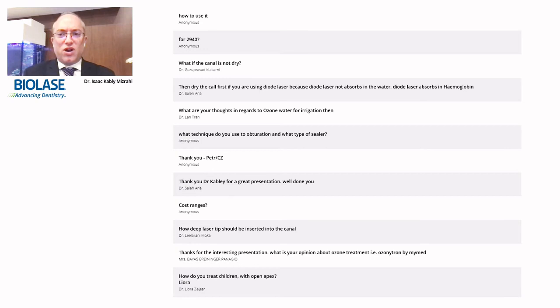My thoughts on ozone water. Well, there are several studies that combine lasers and ozone water. I have no problem with it as long as you combine it with the erbium chromium YSGG, and if allowed in your country, then combine it too with the 940 so you can get the perfect disinfection protocol.